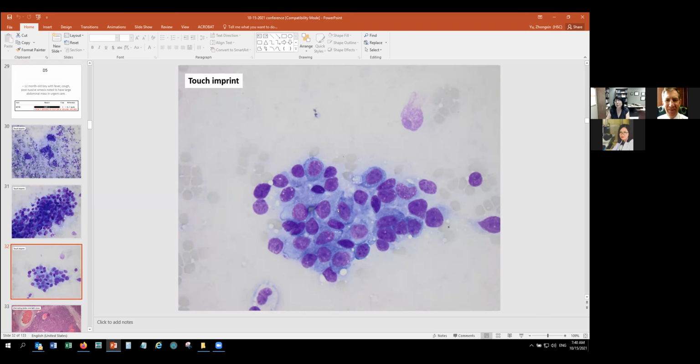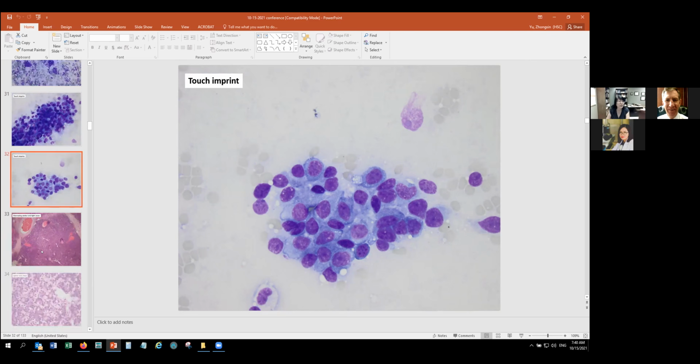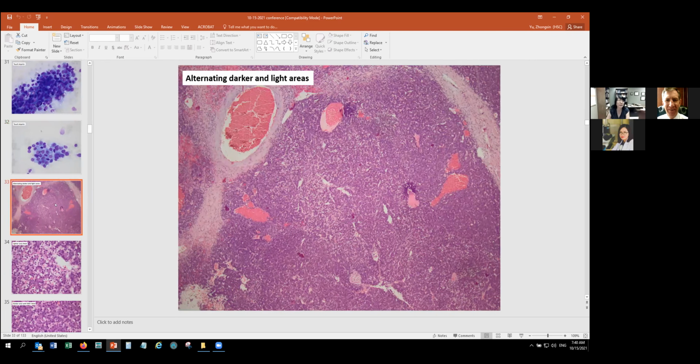Then you can divide the tissue. First priority is permanent sections to make a diagnosis. If enough tissue, we save some fresh for COG, because every child is enrolled in a trial, and also save some for possible genetic testing. That's what we do.